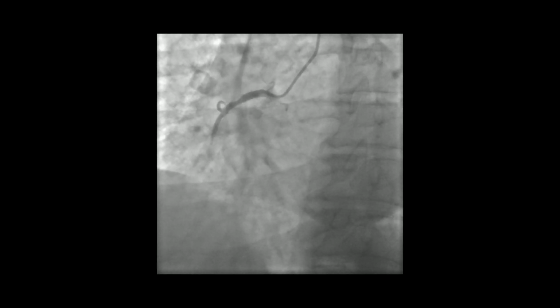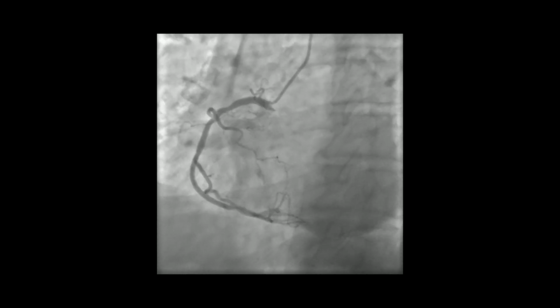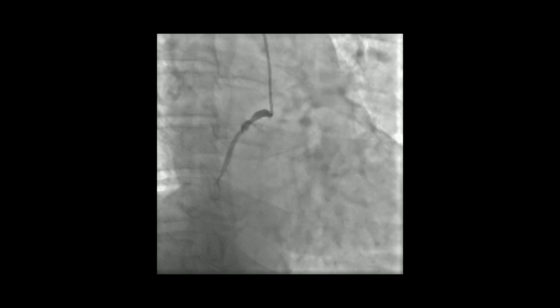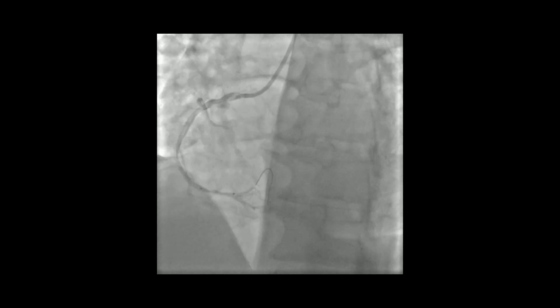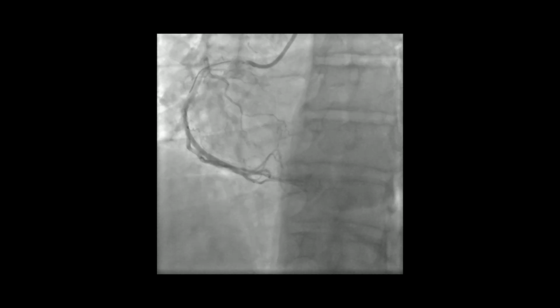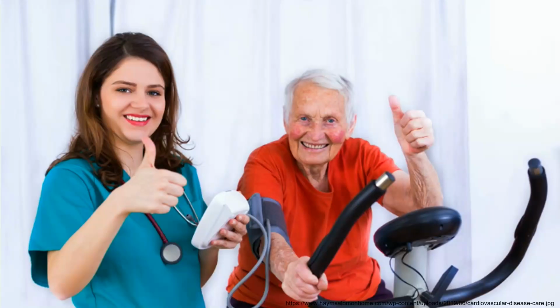There's a hazy proximal lesion, which I know is not something that I need to worry about. I'm going to assess it anyway with intravascular imaging, and I think Carlos talked a lot about P4 and whether or not we need to use intravascular imaging. I would love to discuss that a bit further if time allows, but distally there is a severe stenosis, and from my standpoint, it's a straightforward imaging-guided PCI, where we're able to use a single stent after using appropriate intravascular imaging to define the size of the blood vessel before and after, optimize, treat, and leave that proximal thing alone because it's not physiologically significant, and I don't want to treat something that's not going to improve that patient's outcome.